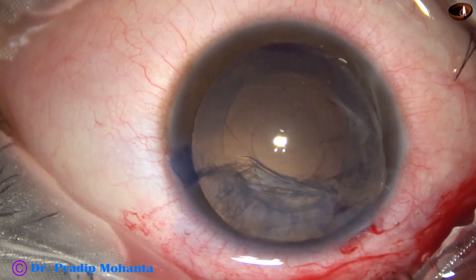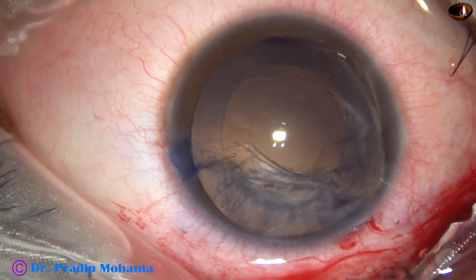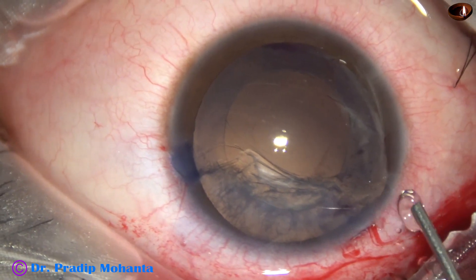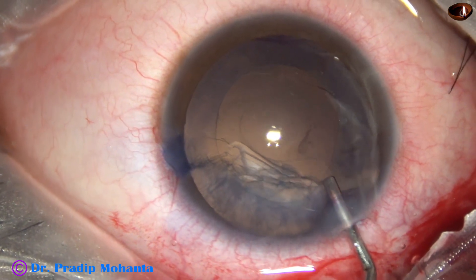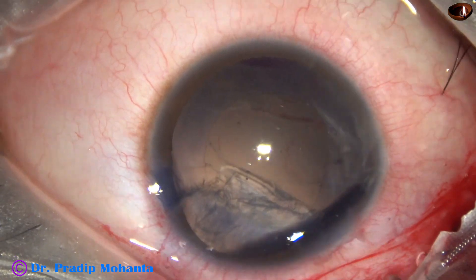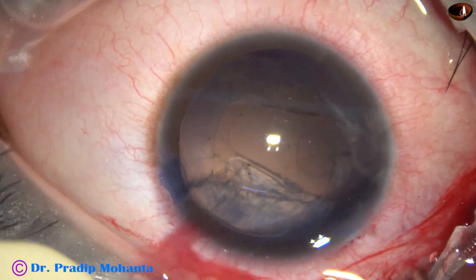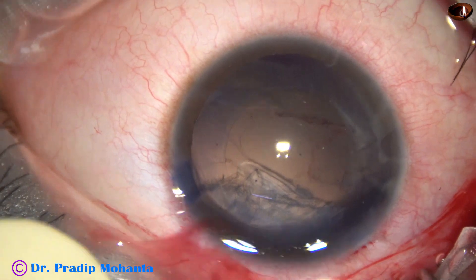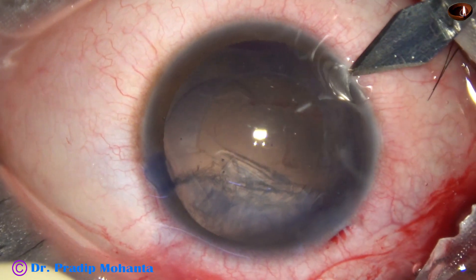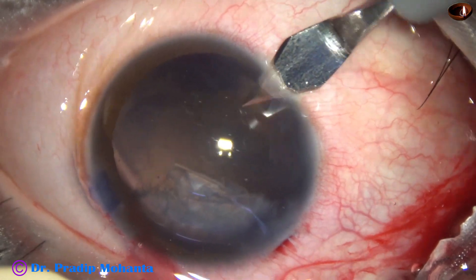I regurgitate a bit of lens matter and come out. I inject viscoelastic and the vitreous goes back. Now I want to aspirate the cortex from 12 o'clock and 1 o'clock.